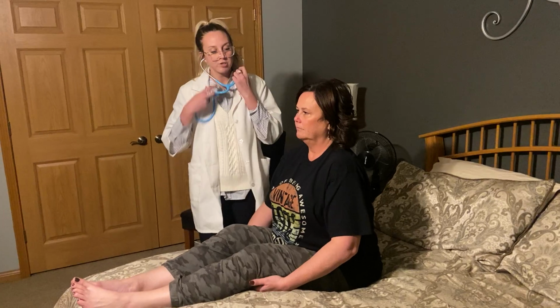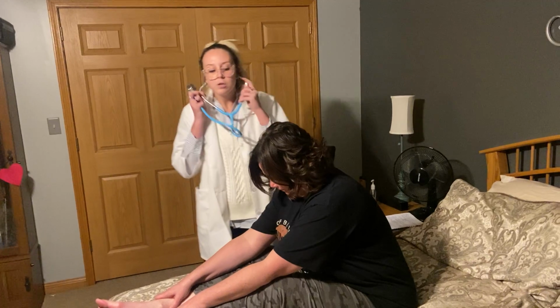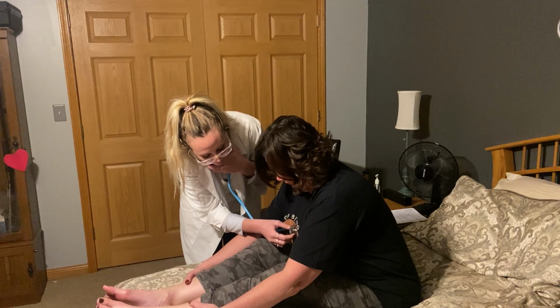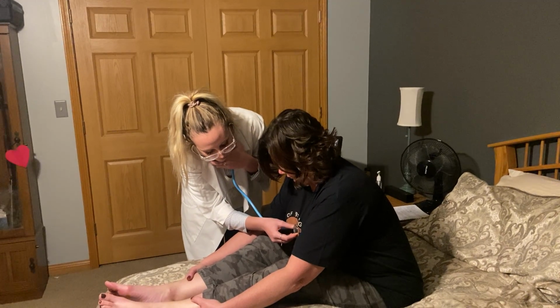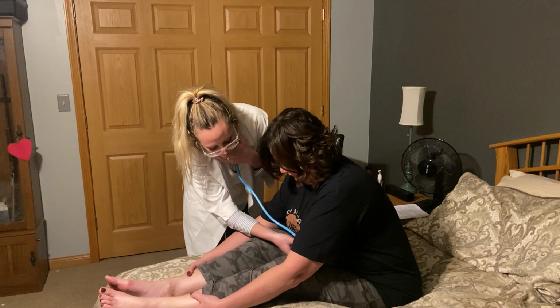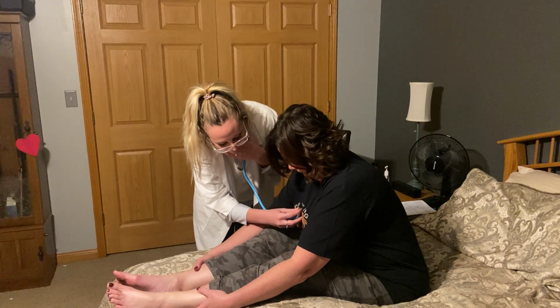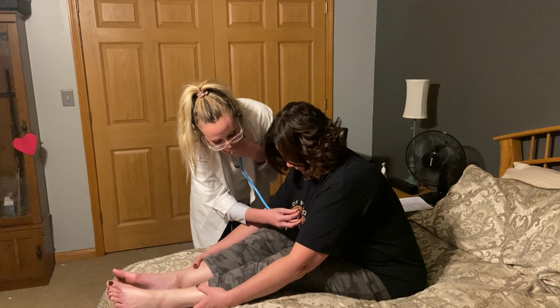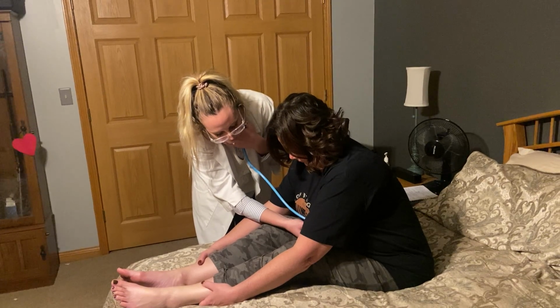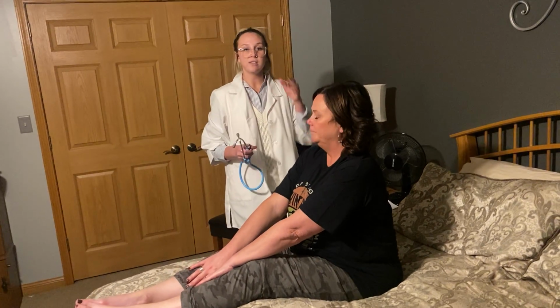Okay, very good. And now, Rhonda, I'm just going to have you lean forward a little bit, okay? Mm-hmm. Good. And I'm going to do the same thing, listen in all the spaces again. Flip to the other side. Okay, very good. So now that will complete the cardiac exam.